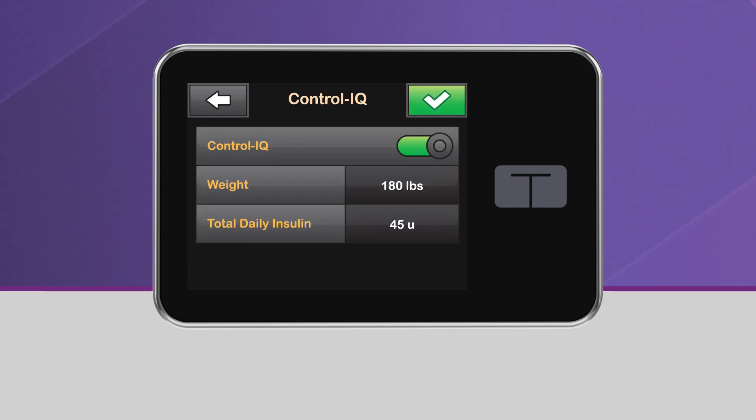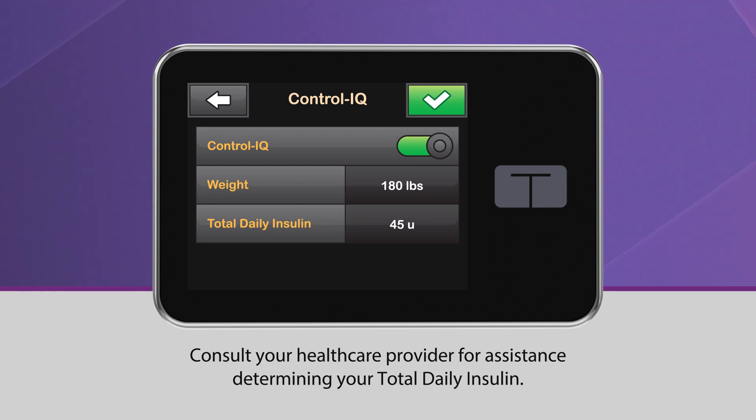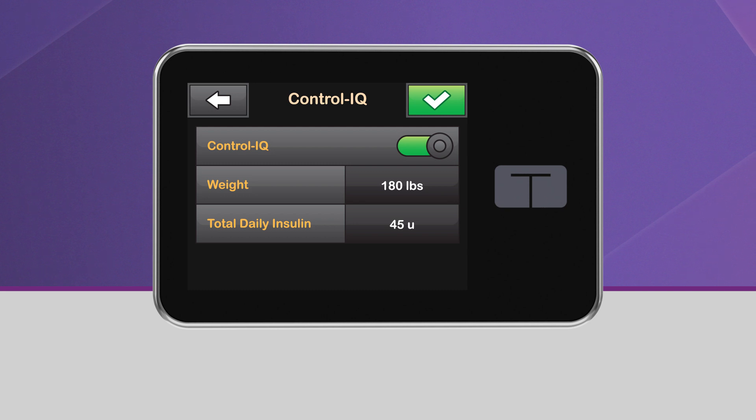Please note that Control IQ Technology cannot be enabled unless both your weight and your total daily insulin are entered. For assistance determining your total daily insulin, please consult your health care provider.